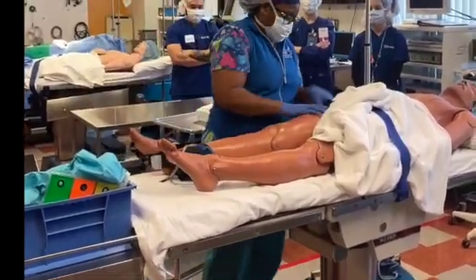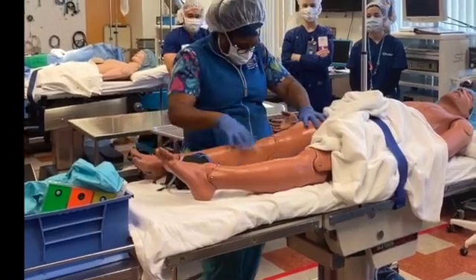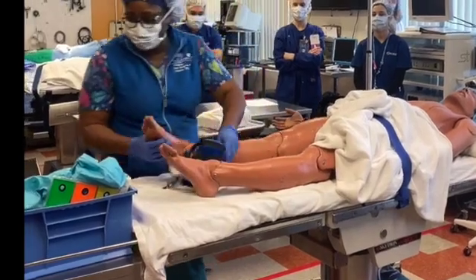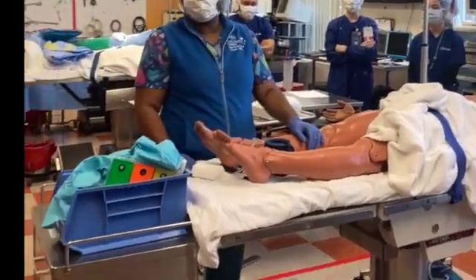All right, my skin looks good. No abrasions, no cuts. It's kind of old, but hey, that's cool. Wrap area for tourniquet placement with cotton padding.